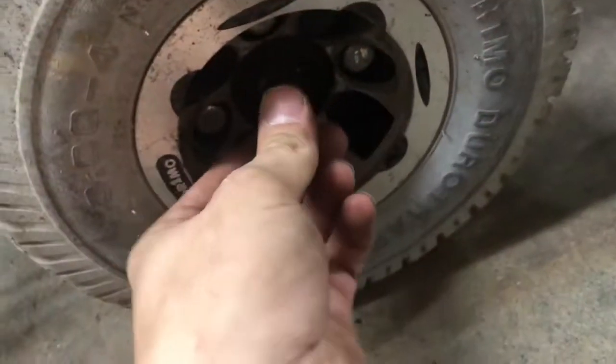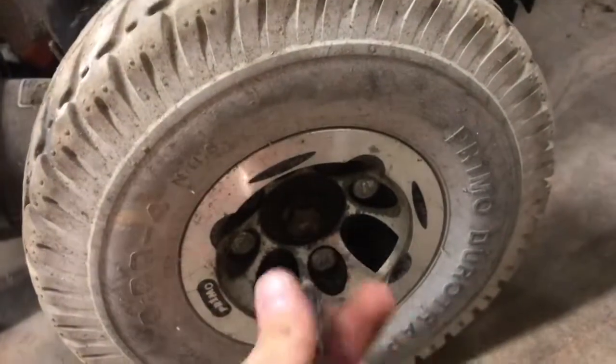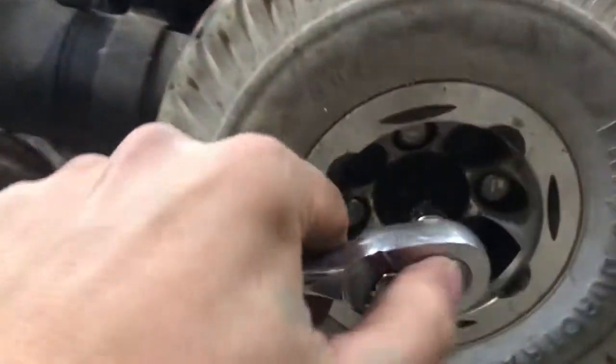Okay. Here we go. This is obviously a half inch. Okay. I will loosen it. Here we go.